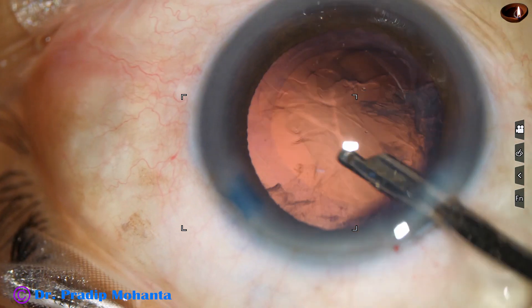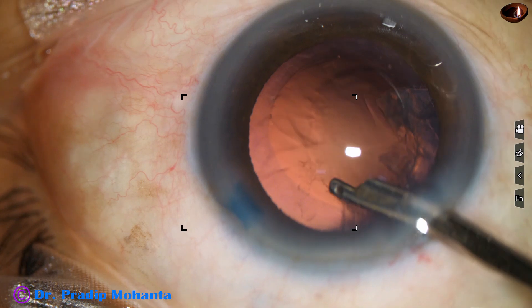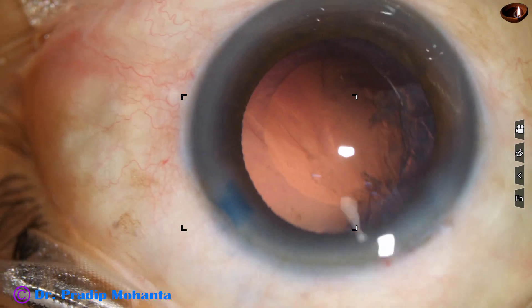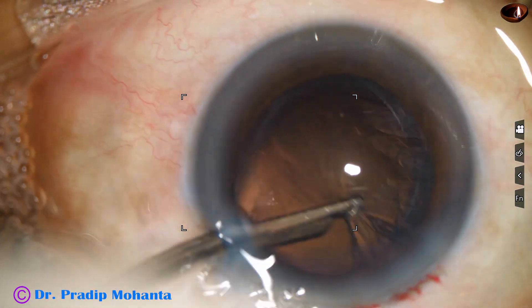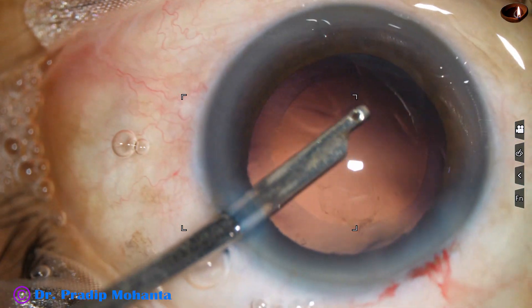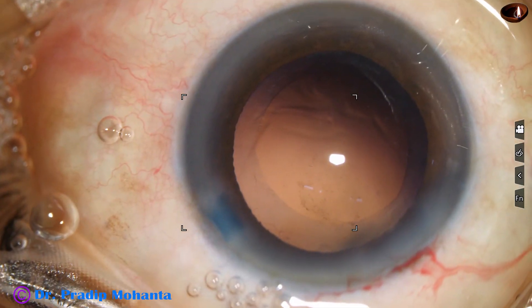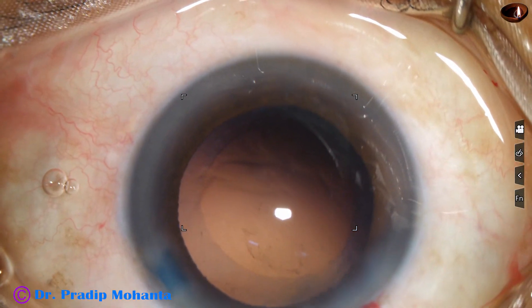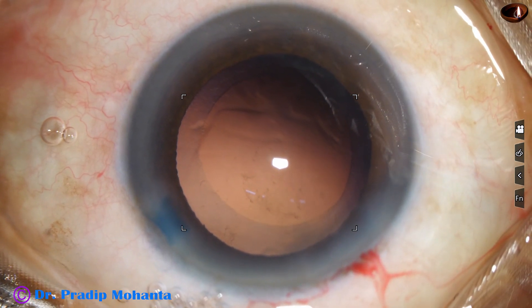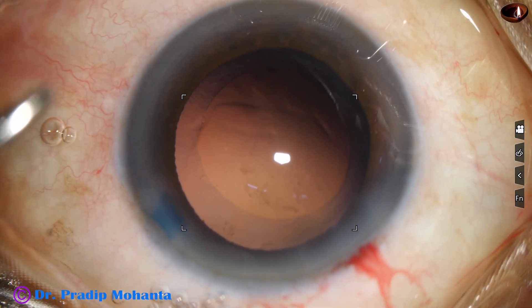Now I use a 23-gauge Simcoe and remove the cortex from the left side. The width of the side port is about 1.6 millimeter, and this 23-gauge Simcoe goes easily through the side port. If necessary, we can make the side port 1.7 or 1.8 millimeter. Place the side port 90 degrees away from the main wound so that astigmatism induced by the main wound is neutralized to some extent by the side port.